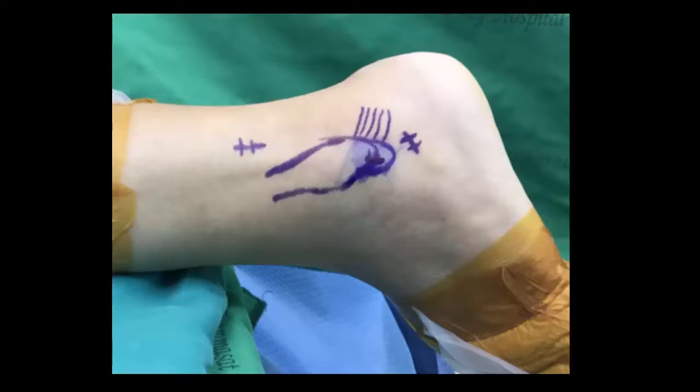For spinal anesthesia, the patient was placed in the prone position. The prone position was used because it provided better access for making the portals and better convenience during movement of the arthroscope with greater ergonomics. A pneumatic tourniquet was applied in the proximal thigh.